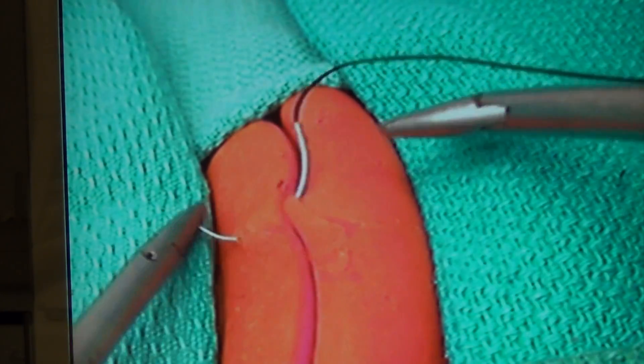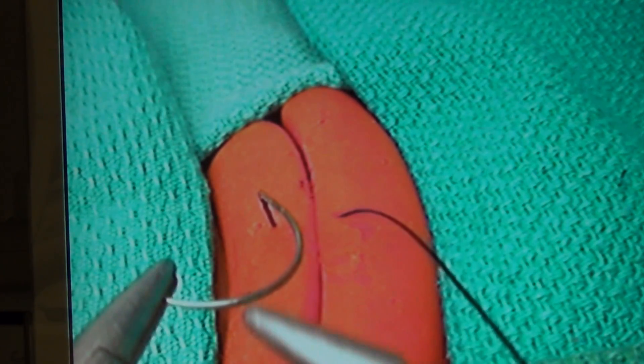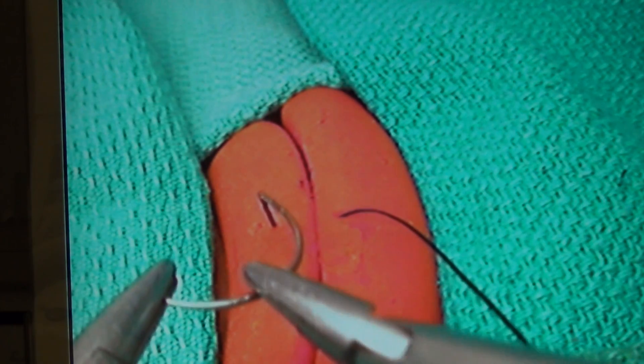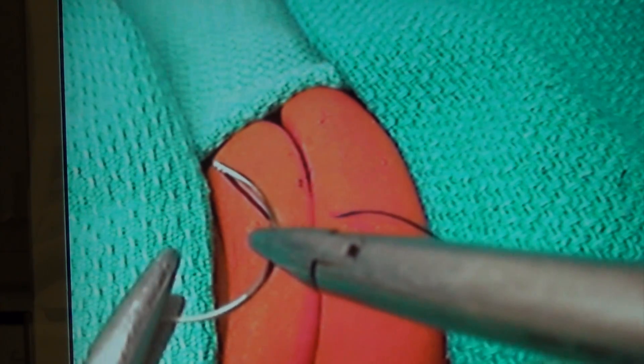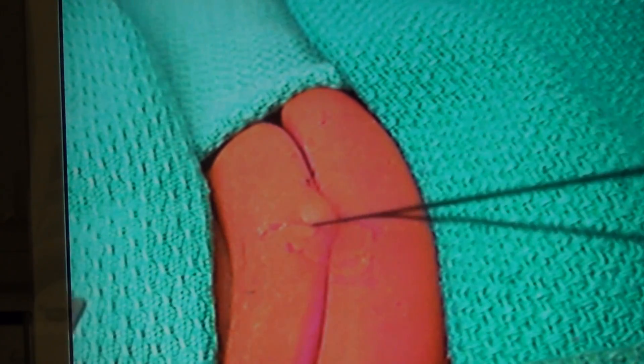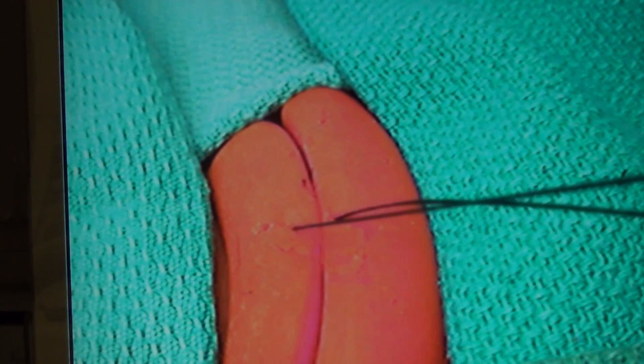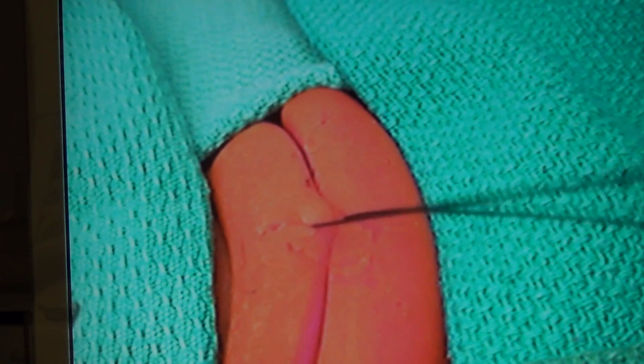Place a suture into the tissue. Keep the suture length long. Leave the tail end of the suture outside of the port. Bring the needle end of the suture out of the port opening. Cut the needle off the suture.